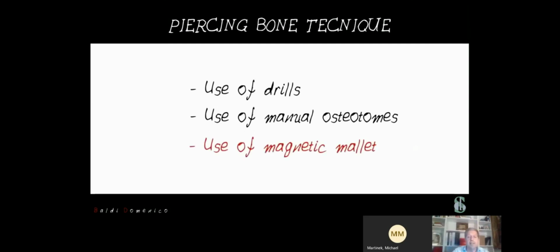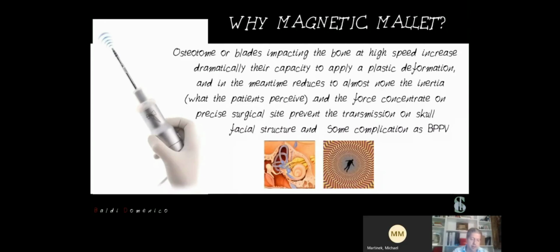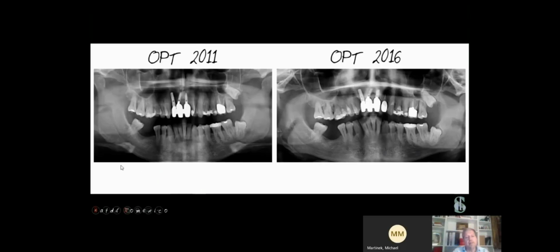But nowadays, using the magnetic mallet, we can change our ideal surgery, because with the magnetic mallet we can do at the same time the perforation of the bone and the elevation of the Schneiderian membrane. And with the magnetic mallet, we have another advantage, because we know that if we use a manual instrument, the manual osteotome, we can have a vertigo situation.